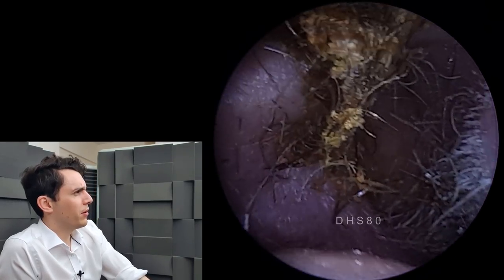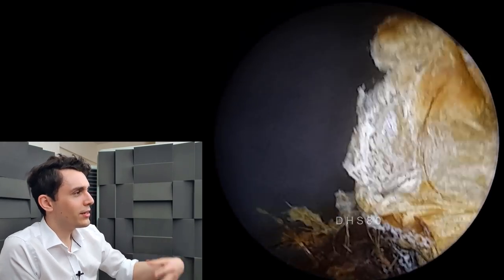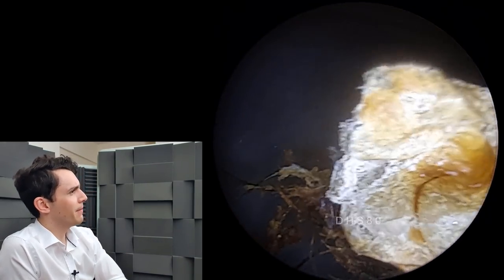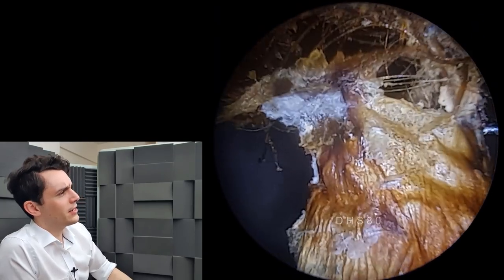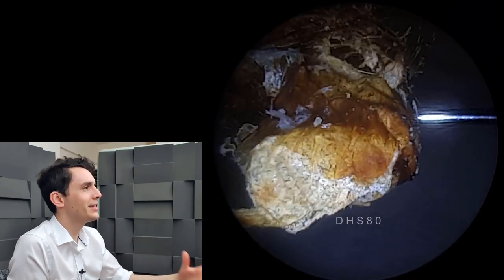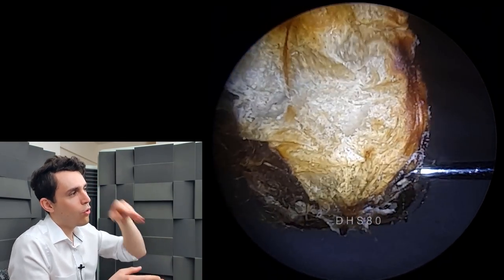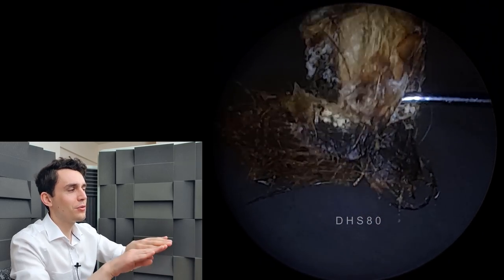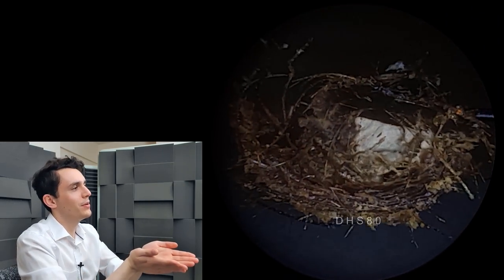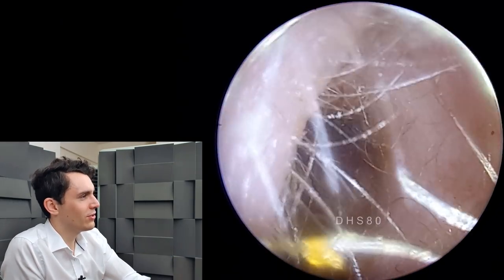There we have it — there's the plug matrix. It is an absolute mess, really, all intertwined. So there's the tissue paper there. Funnily enough, the tissue paper was actually deeper than the wax, and I'm not entirely sure how that happened, but it's almost like you have this core of tissue paper, and then the wax is sort of wrapped around it like a bird's nest. Can you see that? Rather unusual presentation there.